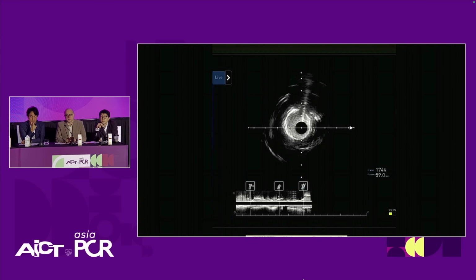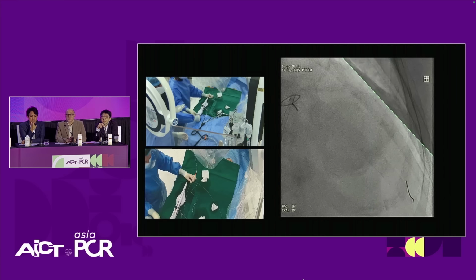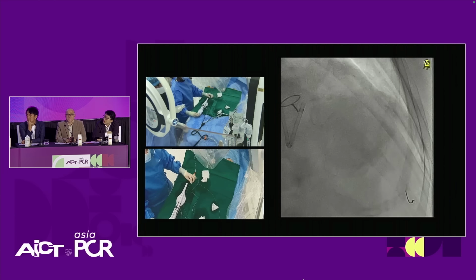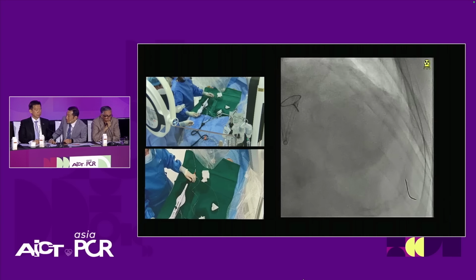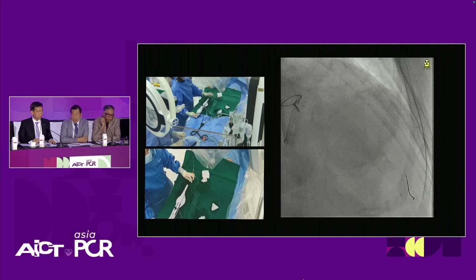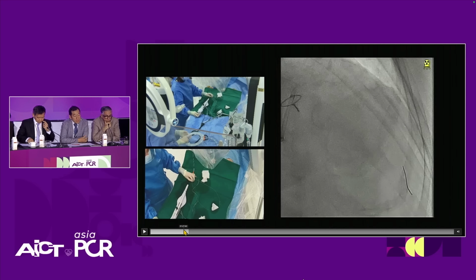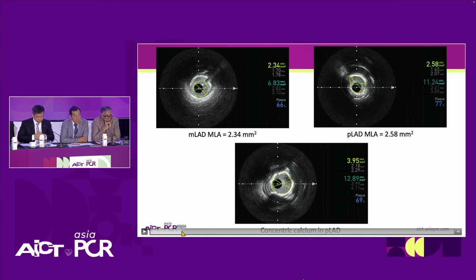I believe we're on the left main, no, that's the ostium, maybe? So if you look at the measurements, perhaps. Sorry, pause. Can you get near to the laptop and just pause it, and then we can discuss a little bit about the IVUS findings? The strategy. If you could go back a little bit. Okay, all right, this is perfect.